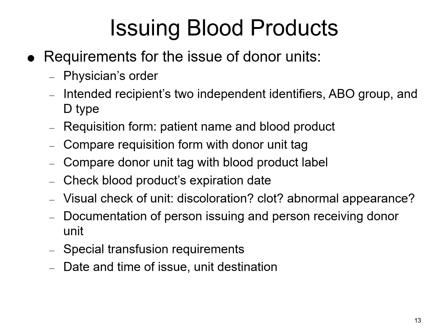Any kind of special requirements have to be included on that label, or you have to let the nurse know. So let's just say, for example, you're issuing platelets that have not been leukoreduced already, but there's a request for leukoreduced platelets, then maybe you have to issue the filter. Or let's just say it's a patient that has a cold antibody of some sort, and it's recommended that the unit be used with a blood warmer, so it actually warms that blood as it's being infused to reduce any sort of agglutination or response due to those cold antibodies.